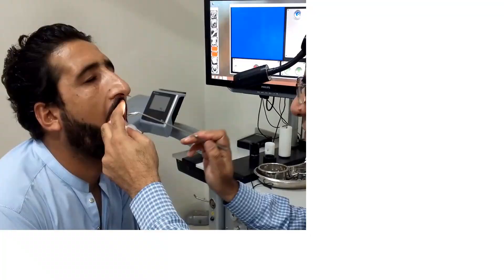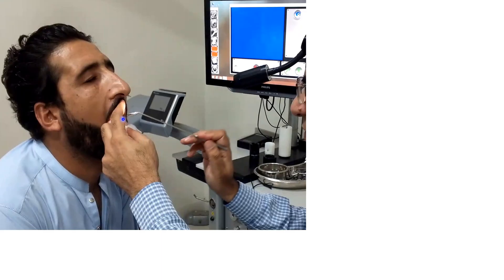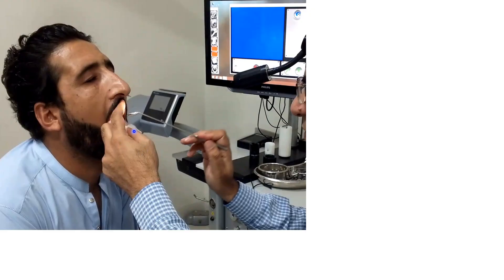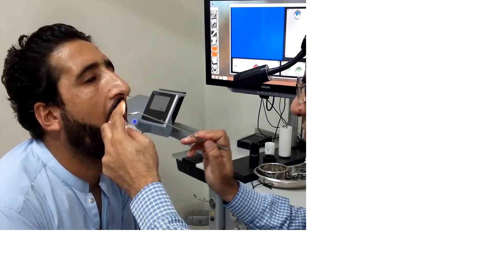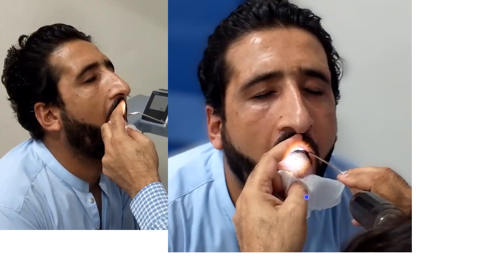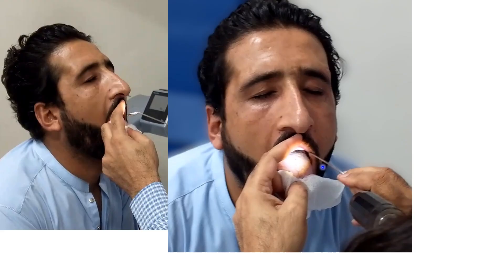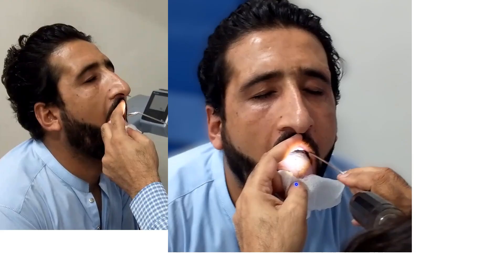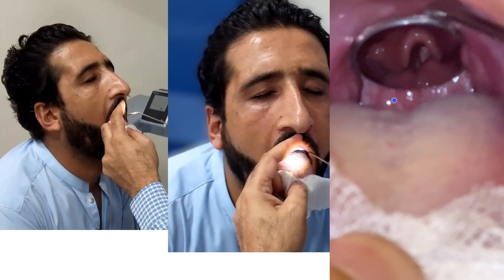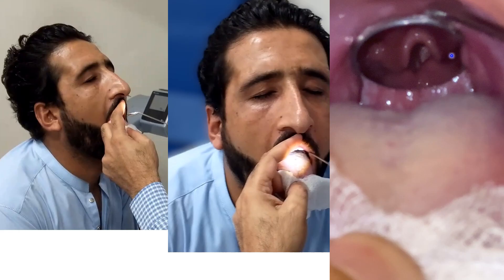In this view with an actual patient, I am holding the tongue and retracting the upper lip with my index finger while introducing the mirror facing downwards. The front view shows how the lip is retracted and the tongue is held between the thumb and middle finger with a gauze piece. The mirror is lifting the uvula up and we are able to see the structures below.